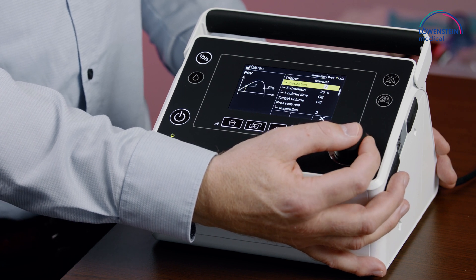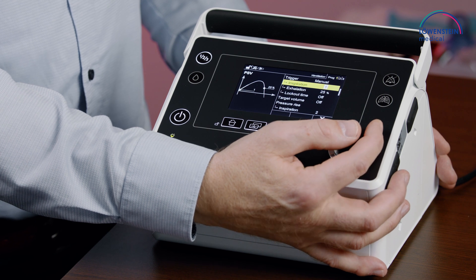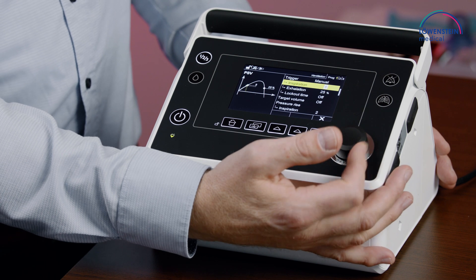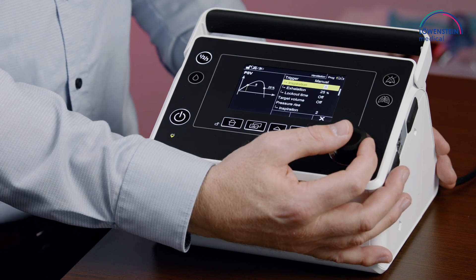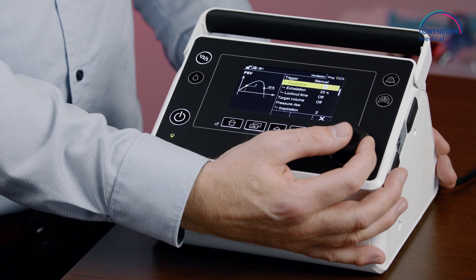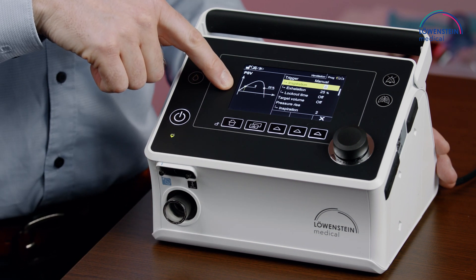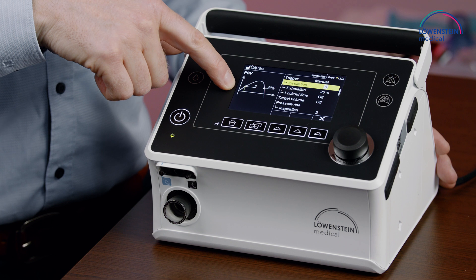We can set the inspiratory trigger in eight steps, where step one is the most sensitive and step eight is the most insensitive. On the left, you can see a graph that helps to see what setting is done.